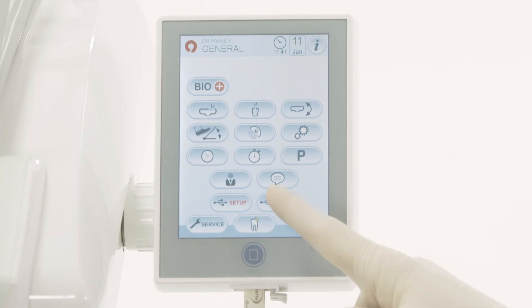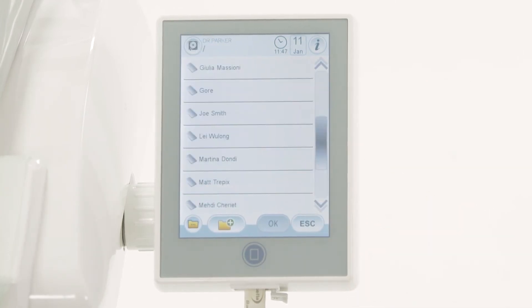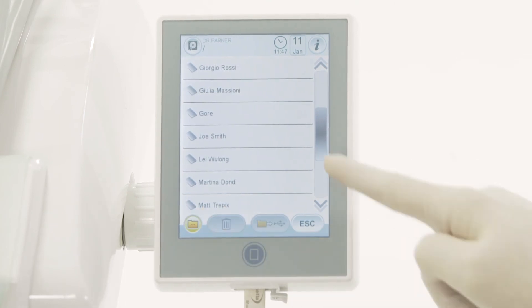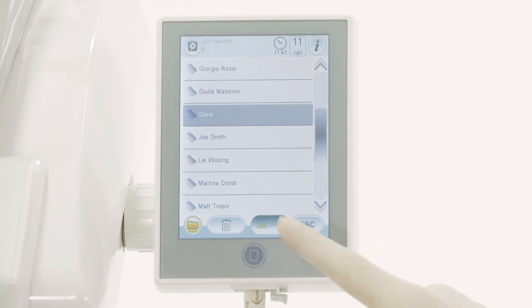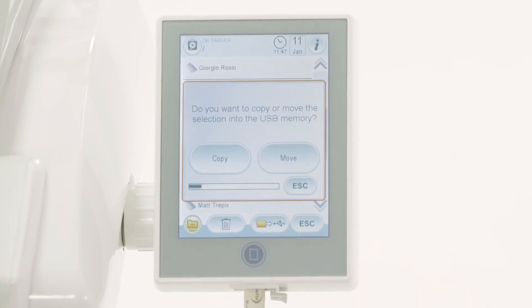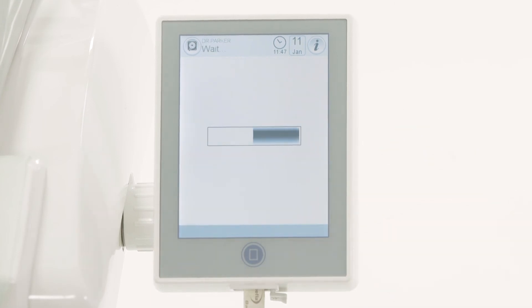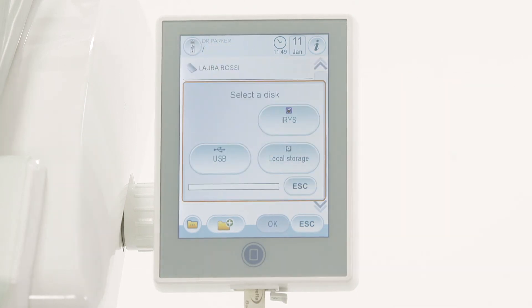Access the image menu and select the local memory. Enable special features, select one or more folders, and press the transfer button. Choose whether to copy or move. For the reverse operation, select the USB flash drive from the menu and proceed in a similar manner.